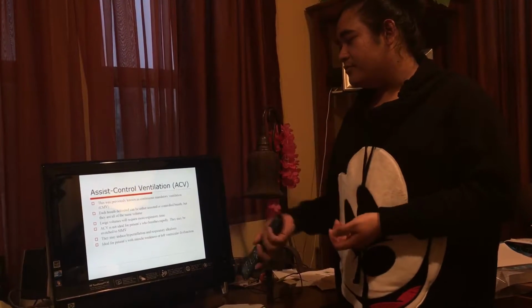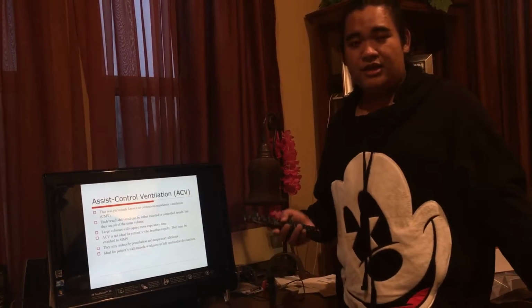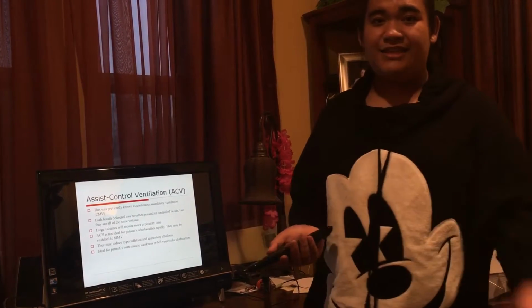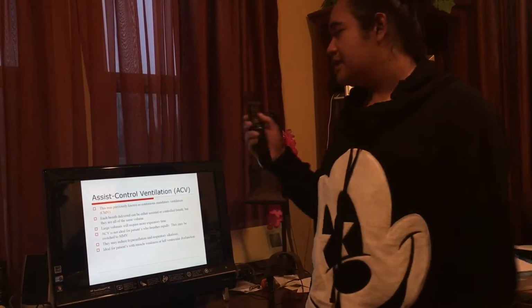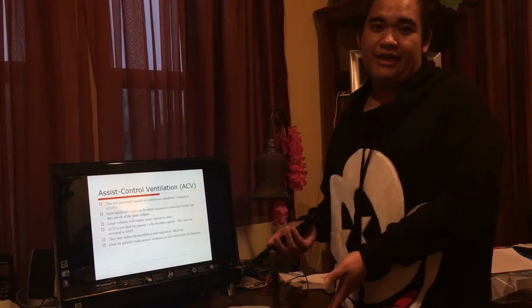Patients with muscle weakness can trigger spontaneous breaths. This is good for them because we are giving them an actual set volume, so there's more gas exchange that can happen. That's basically what volume control is, just a quick touch-up on what it is.